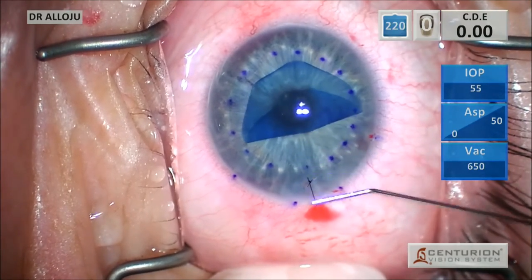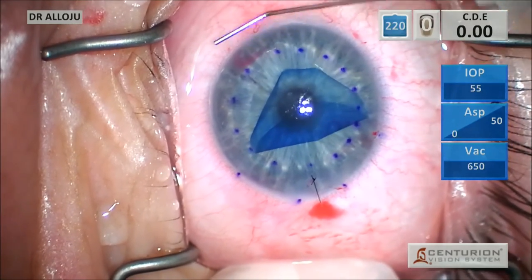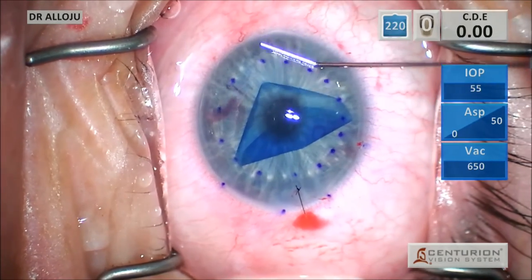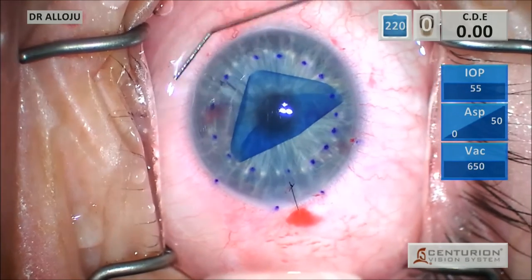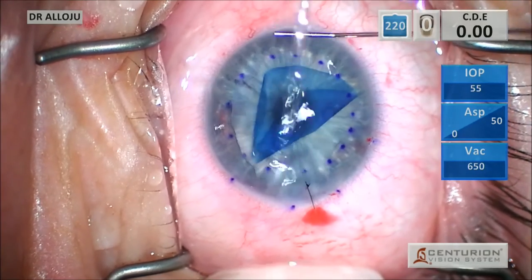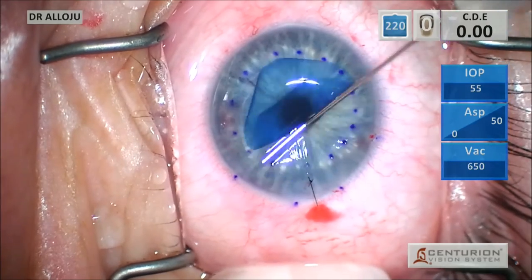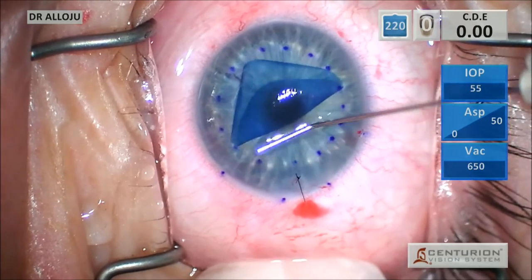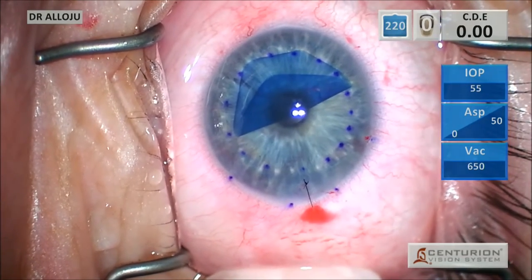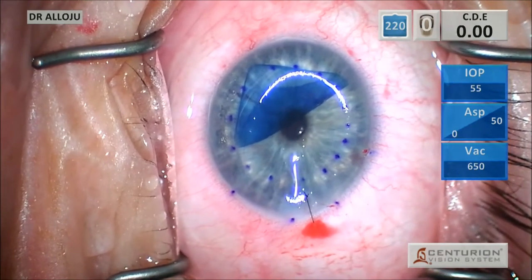Now this is getting close to the ideal position, but as you notice, as I'm trying to unfold the graft, the whole graft is actually moving down, which at this stage essentially means I'm going to need to pin the graft and help unfold it. Now this ends up being kind of an awkward technique because you have to maintain pressure to help keep your shallow chamber without it collapsing, and you have to figure out a way to pin the graft and then use your other hand to help unfold it.